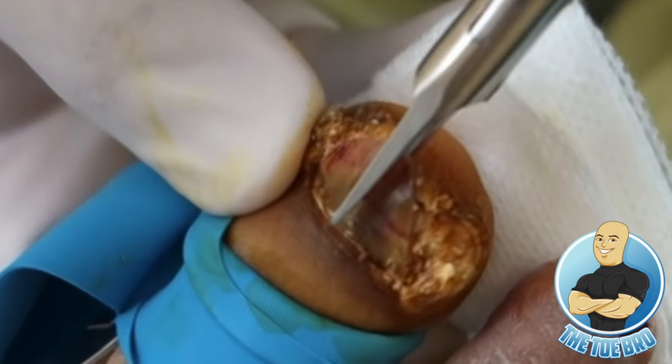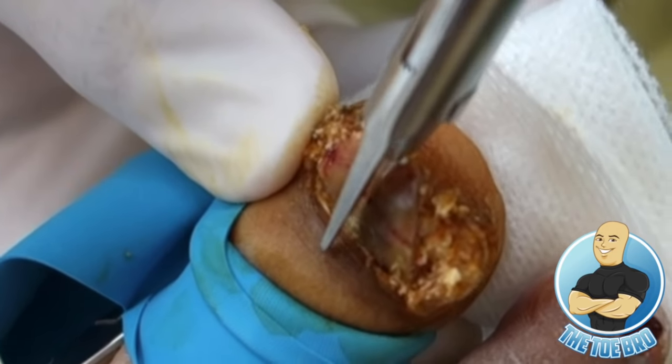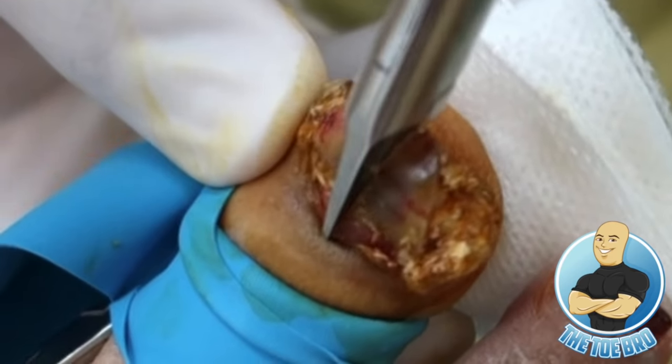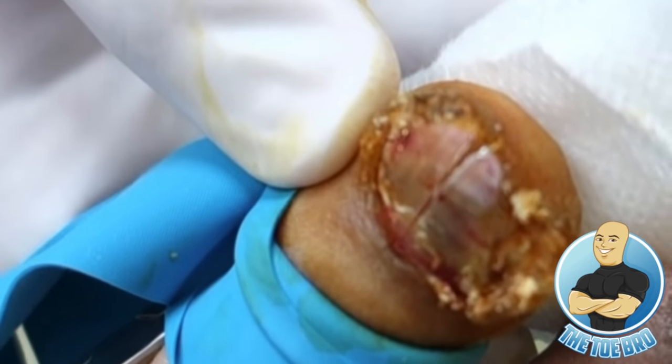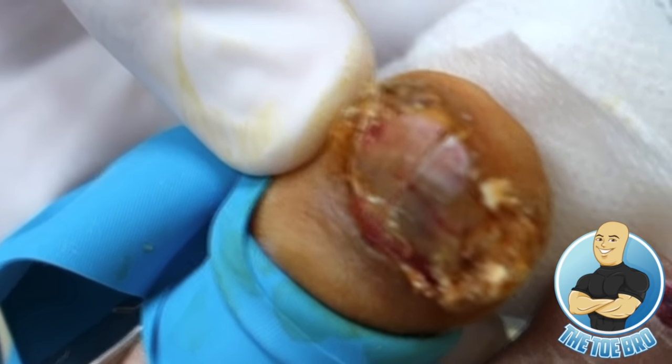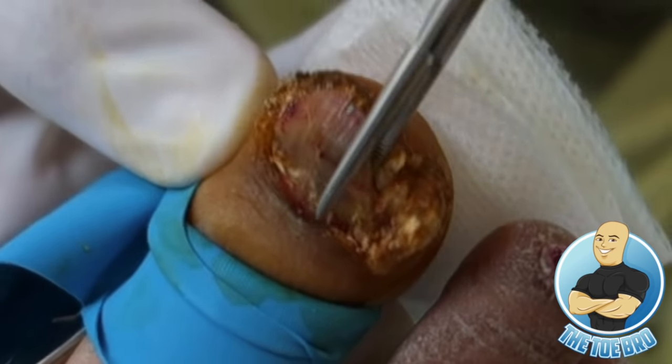After separating the nail from the nail bed and the surrounding tissue, I like to cut the nail in half, and that makes it a little bit easier for me to pull out each half of the nail instead of trying to tear out the whole nail in one piece. It also allows for a little bit less trauma to the area.